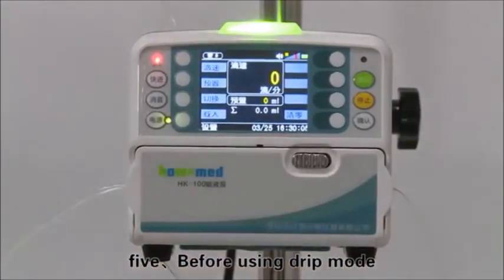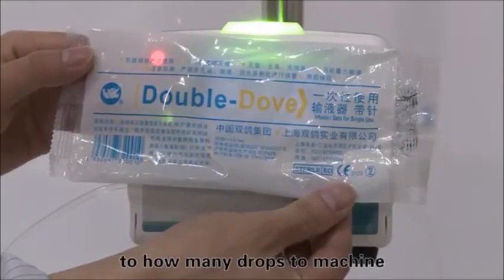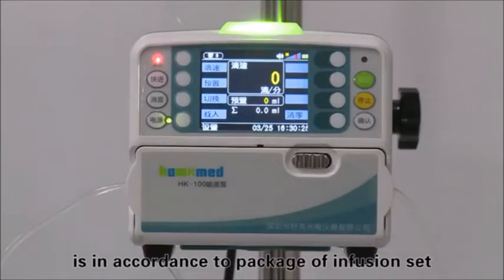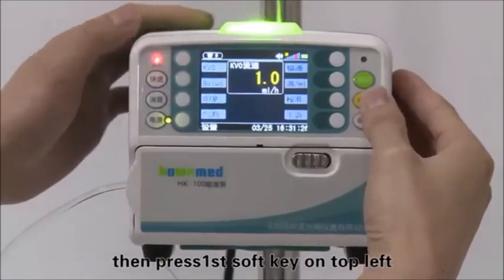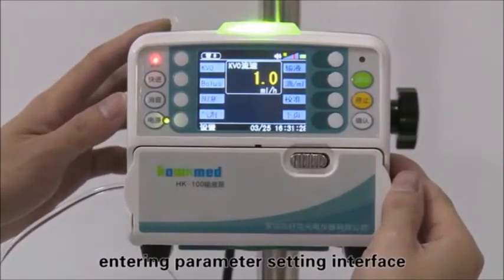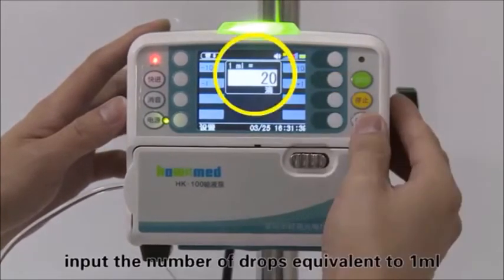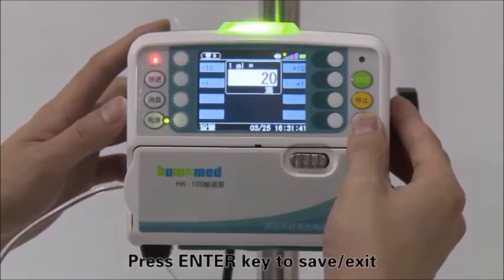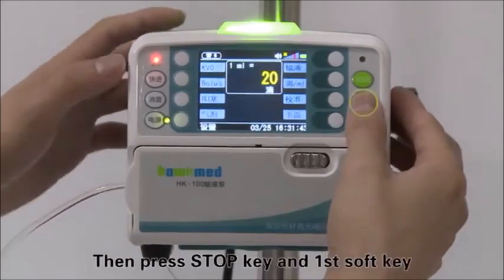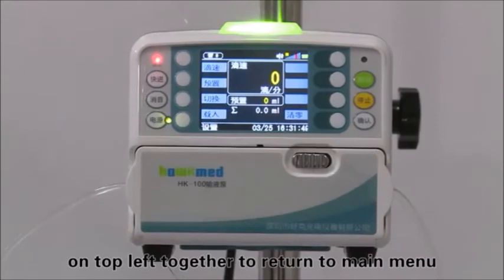Before using drip mode, input the number of drops equivalent to 1 milliliter into the machine. The number of drops is found on the package of the infusion set. Press and hold the stop key first, then press the first soft key on the top left to enter the parameter setting interface. Press the D/ML soft key, input the number of drops equivalent to 1 milliliter, then press the enter key to save and exit. Press the stop key and first soft key on the top left together to return to the main menu.